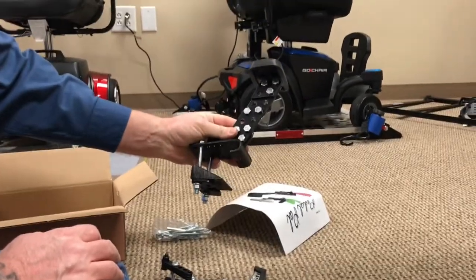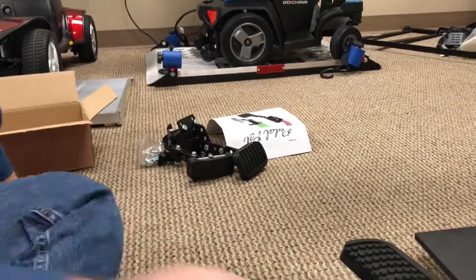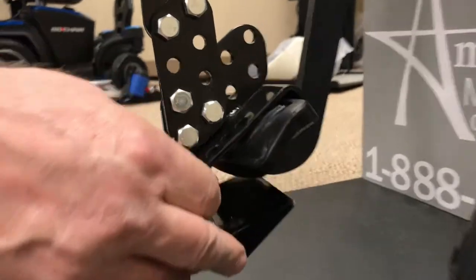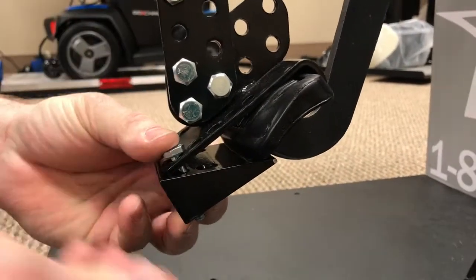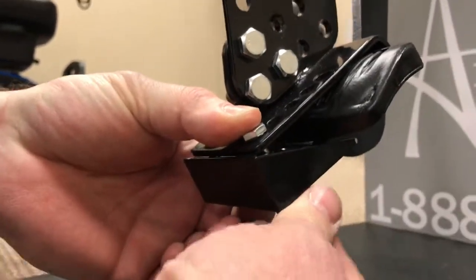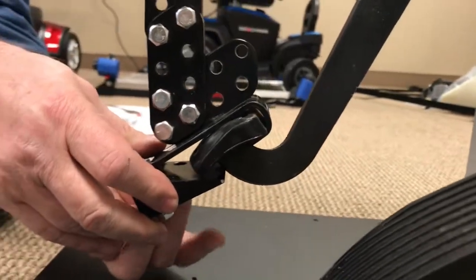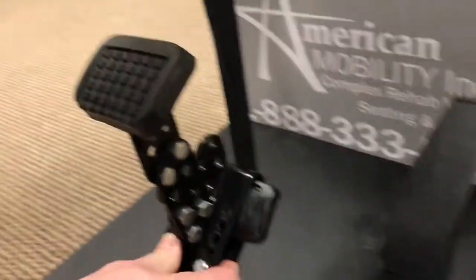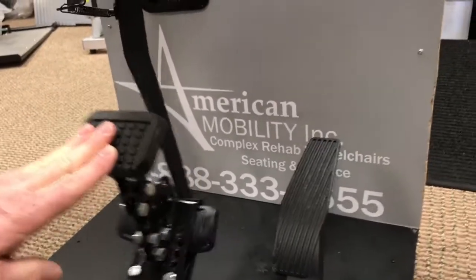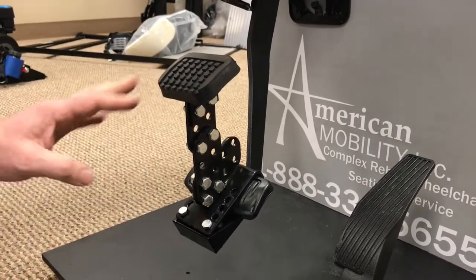It works on any brake pedal too — angles and all that stuff. When you put it in, it's all user preference basically. When you get the brake, you throw the brake on there like that. You got a little wedge and with that wedge you just throw it up in there. Get that down and you'll be able to use your brake no problem. You can always adjust your angles and everything — it's not rocket science.